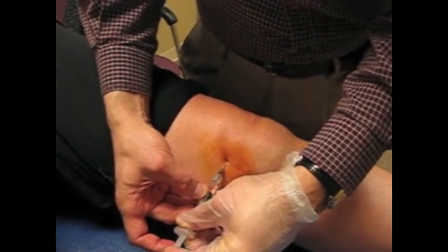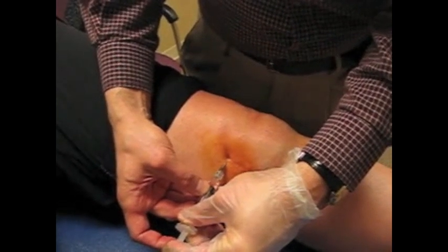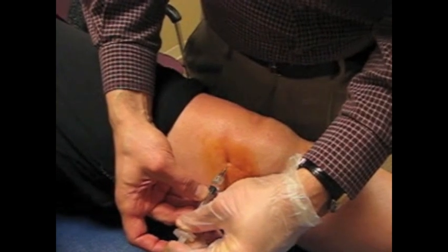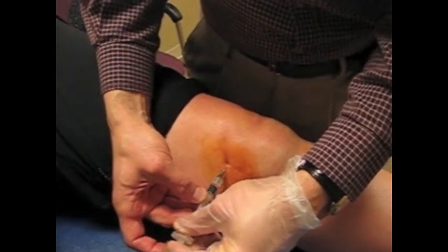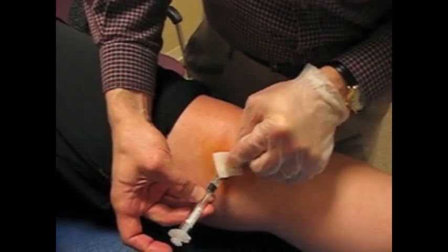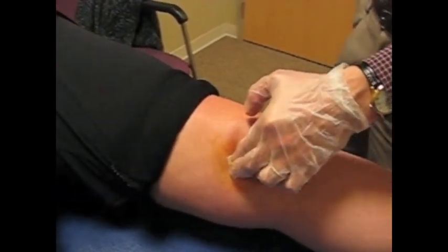Keep administering the solution slowly and always maintain a sterile technique. When done, withdraw the needle, apply local pressure, and cover with a bandage.